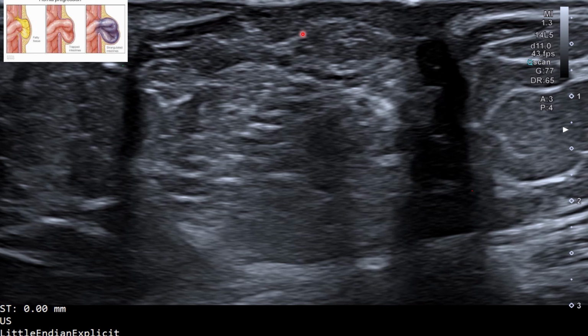So you need to understand and appreciate how you can identify a hernia on ultrasound. So this is a 47-year-old male patient with an umbilical defect, where we are seeing the hernia there. In this, you can see the hernia nicely there.